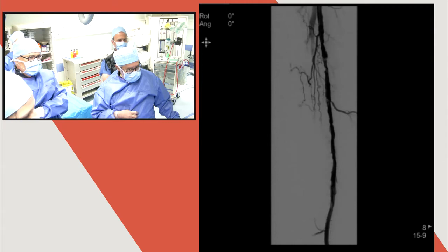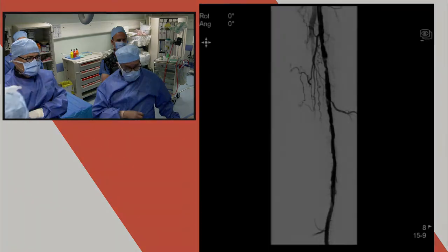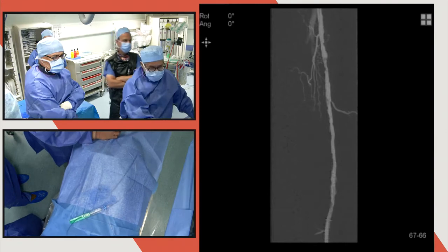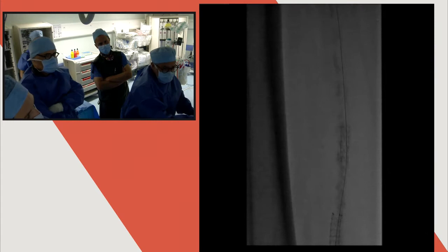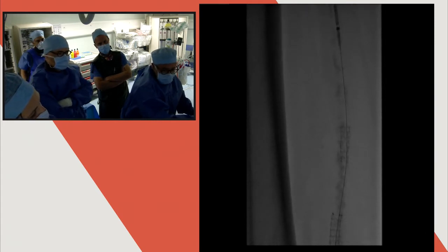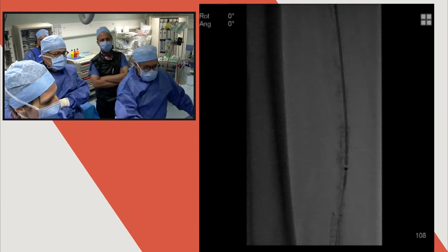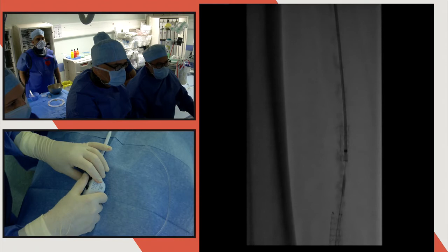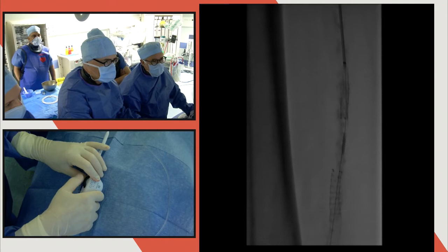So, 6 millimeter Eluvia, by 150, the maximum. Because I want to know precisely where we are going to place that drug-eluting stent. Okay. So we have taken a 6 millimeter. And we should also use a 6 millimeter Ranger balloon. Here it is. Okay. You will do it here? Or a little bit? Could you please? So it's very precise. There's not a lot of movement of the distal segment of the stent.